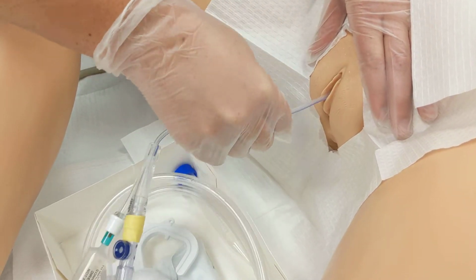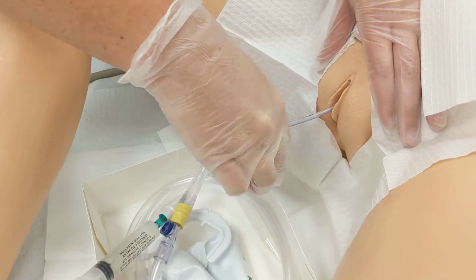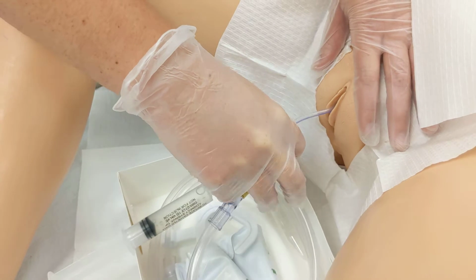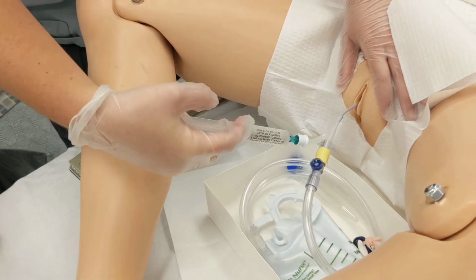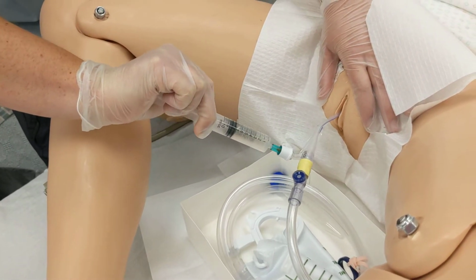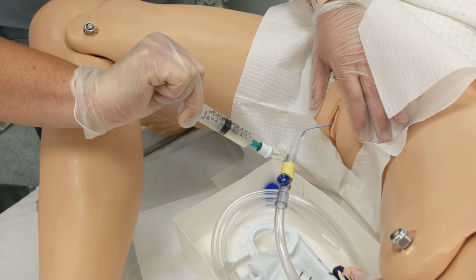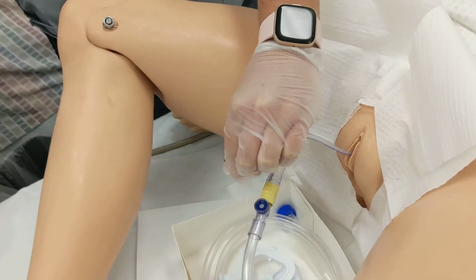We're gonna put it in until we see flashback, which I see, so I'm going to put about 5 mLs in. So to there. Now I'm going to take that off.